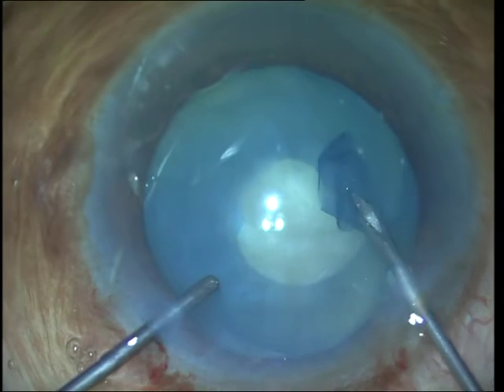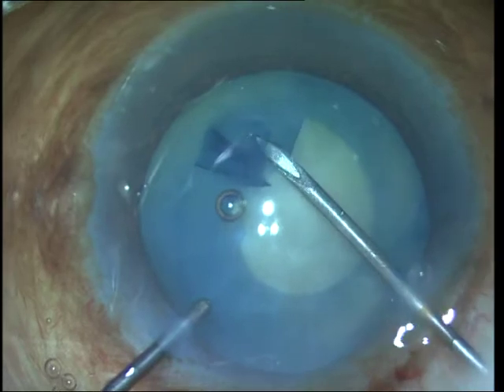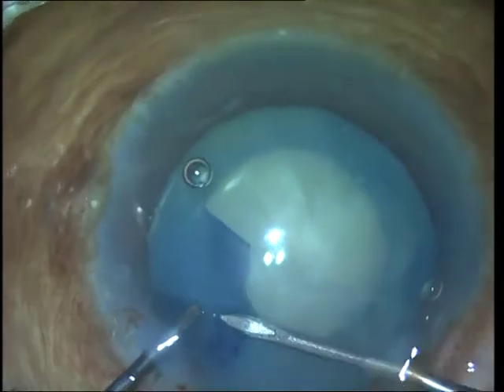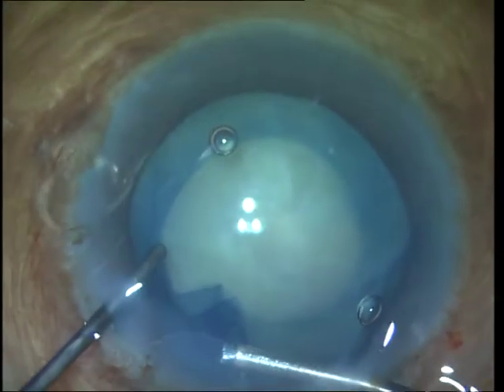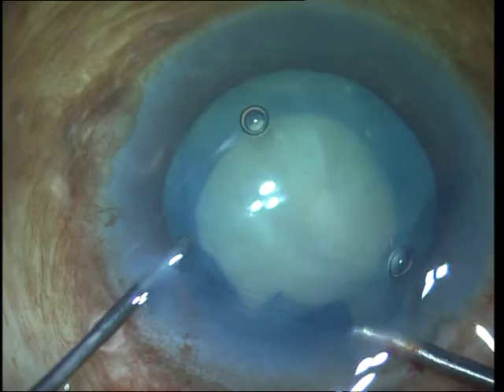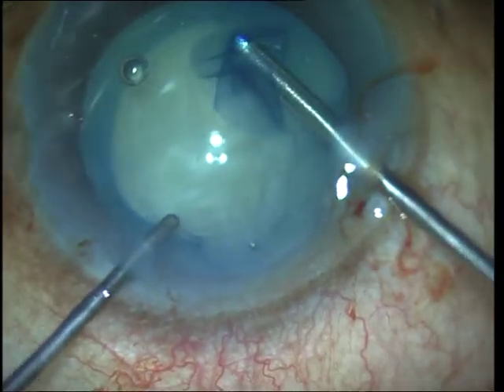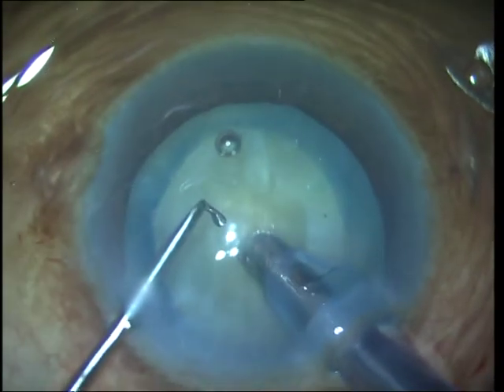What I did in this case was start the rhexis out small so that I have enough space to retrieve the rhexis even if it shows some tendency to run out, and then I spiral it around to control the rhexis to a final size that I desire. I also always keep the anterior chamber pressurized, which can be done by using a high molecular weight viscoelastic as well as by performing the rhexis using micro forceps through the sideport.